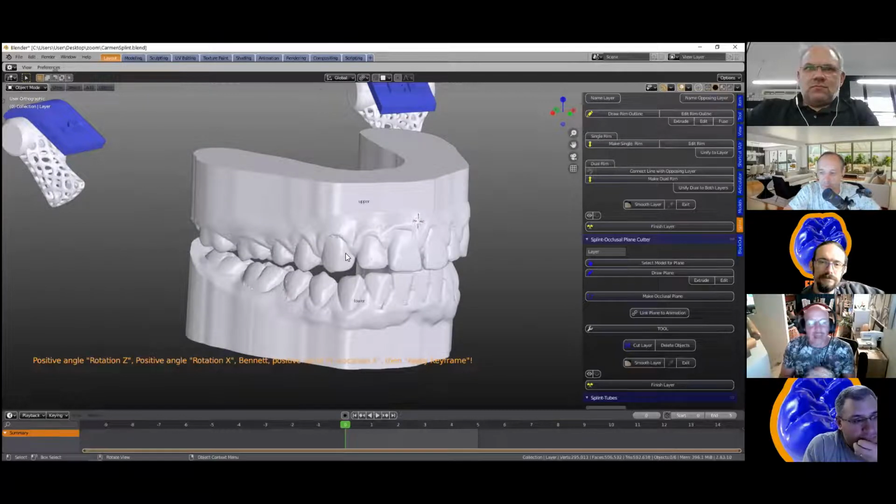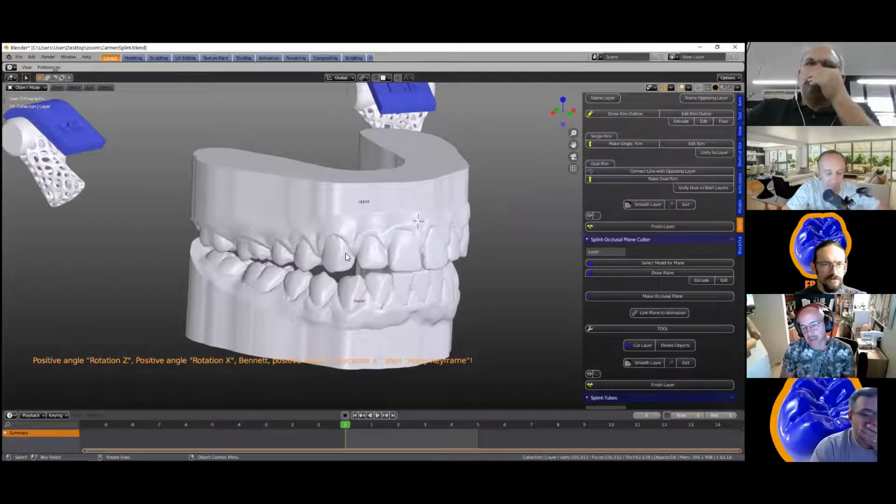There is a Michigan splint which you can do. I've had so many remakes sent to me: oh, this thing pops out of the mouth. We put wire ball clasps in there to keep them in the mouth. Now, we don't have wire ball clasps in the digital world, so we do rely on undercuts, please. So if my splint comes out of the mouth, that's simply because it's poorly designed. We need to engage undercuts in these splints.